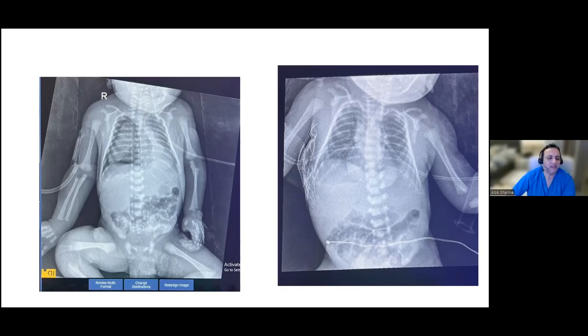Yeah, an hour will make a big difference because it doesn't look as if you have such a large pneumothorax on your ultrasound. Okay, yeah, it didn't look so. So that is why I was curious to go back again and see. And so this is what I found. And when we inserted the ICT, this is the next X-ray after insertion of ICT. Yep. This one. And the pneumothorax was drained.